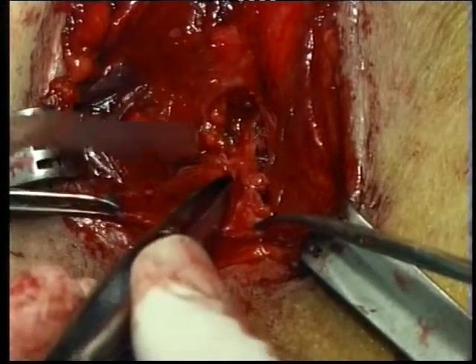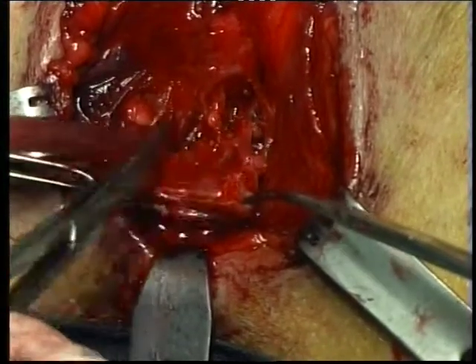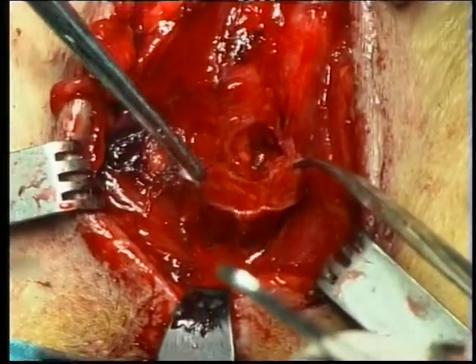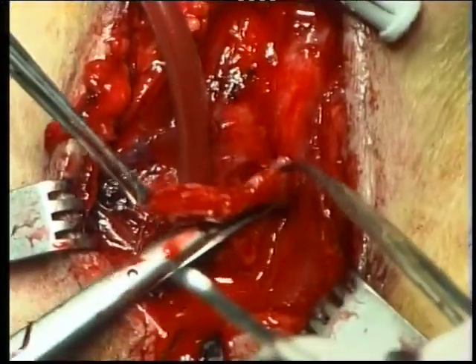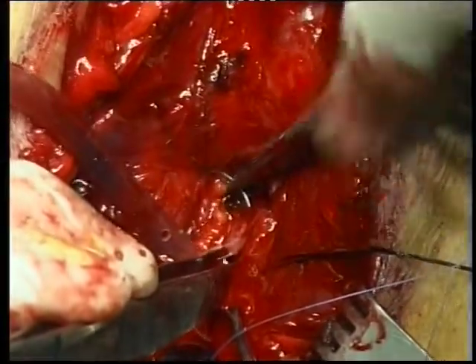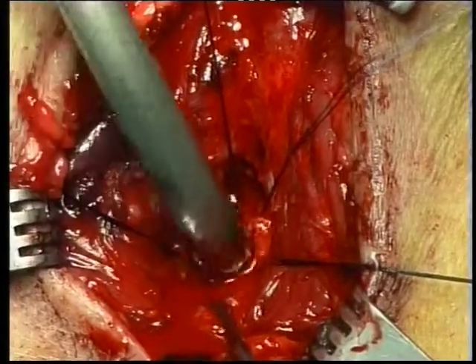The proximal urethral stump is prepared in the same fashion as the distal one. Spatulation should be performed on the dorsal side and all the urethral scar and spongiofibrosis should be excised. After placing the first stitch in the midline on the dorsal aspect, we again verify the excellent caliber of the urethra.